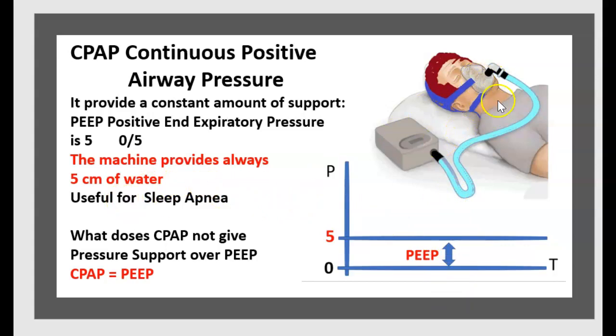We use it in sleep apnea. What CPAP does not give is pressure support over PEEP. CPAP equals PEEP. PEEP is invasive, but CPAP is non-invasive.